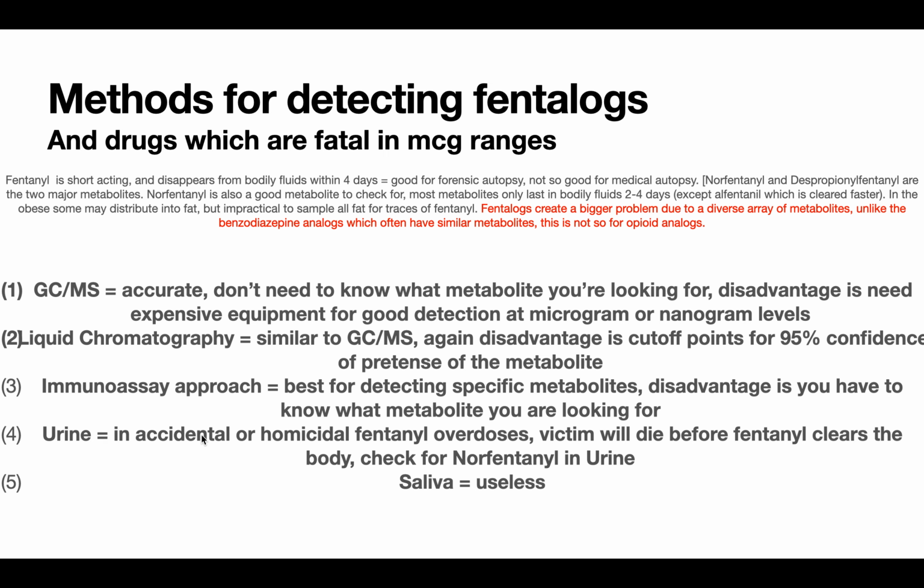Just because it's detected does not mean that it's present. It has to be above the cutoff level, which is a problem when the cutoff level is in the microgram range. However, the equipment today can detect above the microgram level.